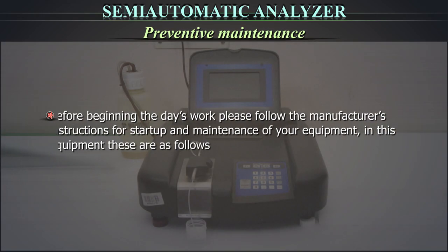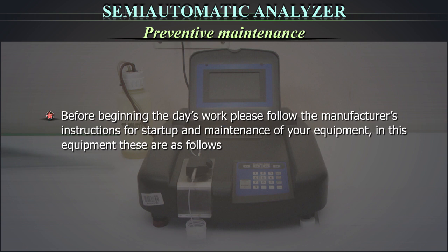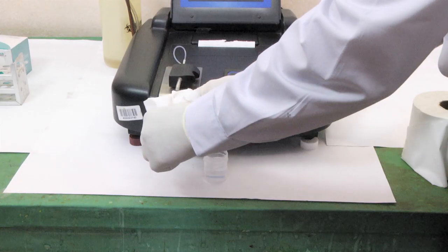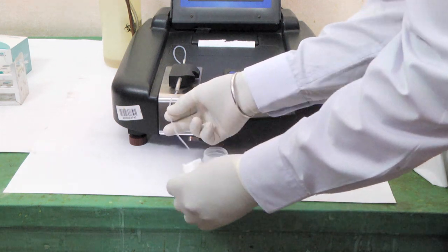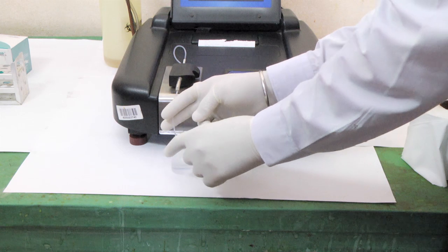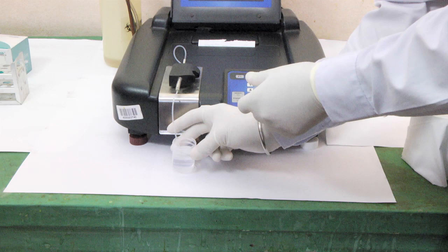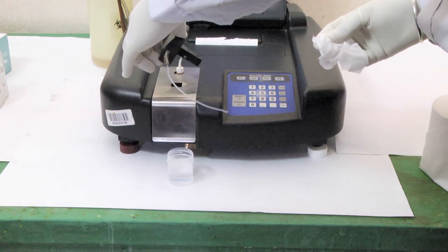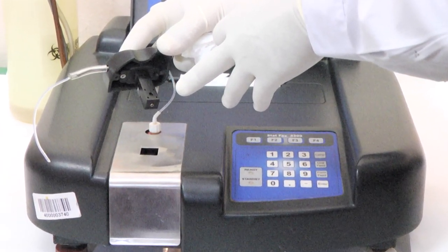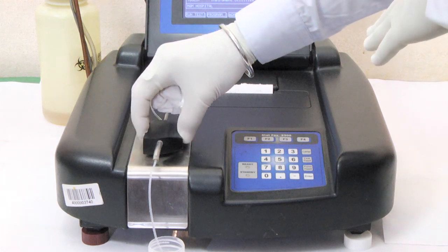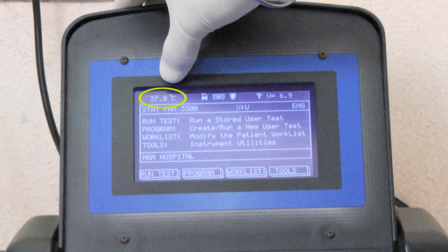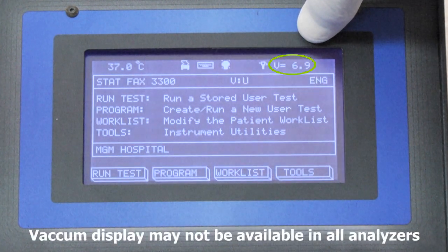Preventive Maintenance: Before beginning the day's work, please follow the manufacturer's instructions for start-up and maintenance of your equipment. In this equipment, these are as follows: cleaning of the probe with distilled water — clean the outside of the probe gently with tissue paper and then with distilled water to dislodge any debris that might have collected inside. Be careful to clean the probe gently, avoiding any bends in the orientation of the probe. Pull out the flow cell gently and check if the window has any dust; if so, clean carefully with a tissue paper and place it back gently. Temperature should be fixed at 37 degrees Celsius and should be achieved within 1–2 minutes of switching on the equipment.